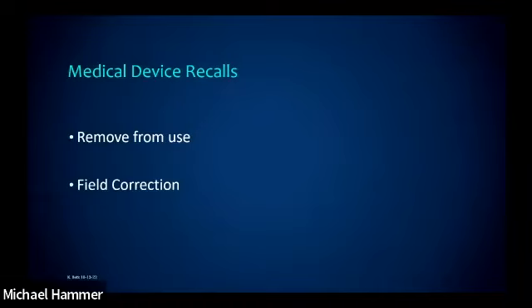So I remember, it was painful. It was probably 6 years back. Do you guys remember when Invacare recalled the joysticks on power wheelchairs? I think we had to remove and replace 28,000 joysticks for our veterans across the country. It was a painful experience, but there was an adverse event that occurred using the joystick on an Invacare chair. And that's a responsibility to remove from use and replace that joystick so that nobody is harmed as a result of that. Invacare handled it appropriately. We took care of our veterans by making that happen.